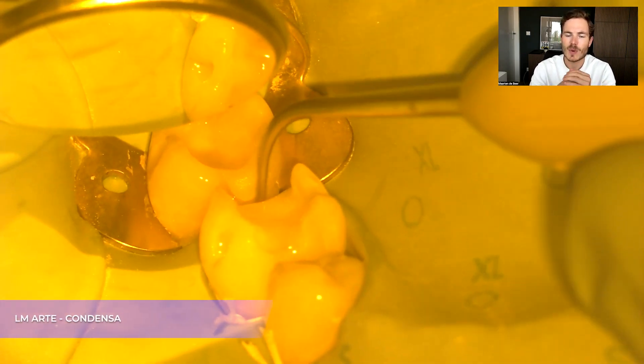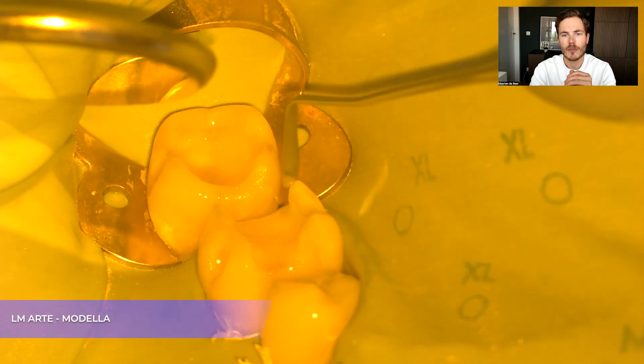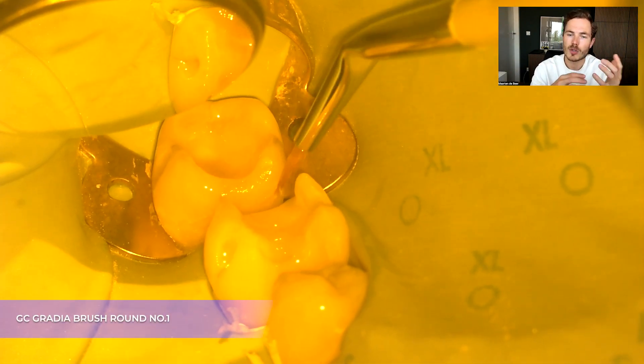I then restore the teeth in their natural form. In this case we had a really small lesion on the mesial of the second molar, so I first start with restoring that. Once the outside of that tooth is done, I can focus on the occlusal part.